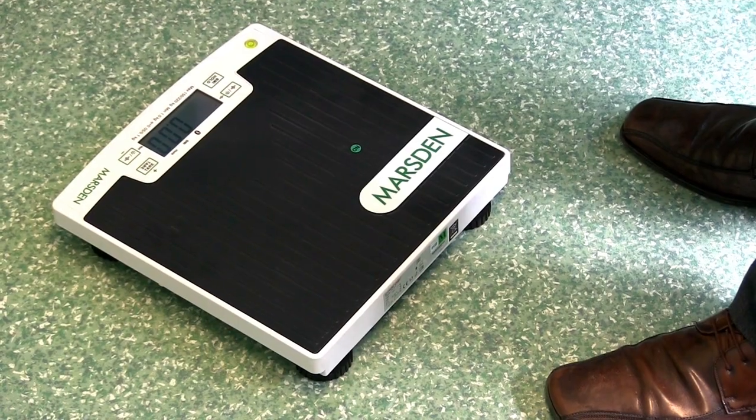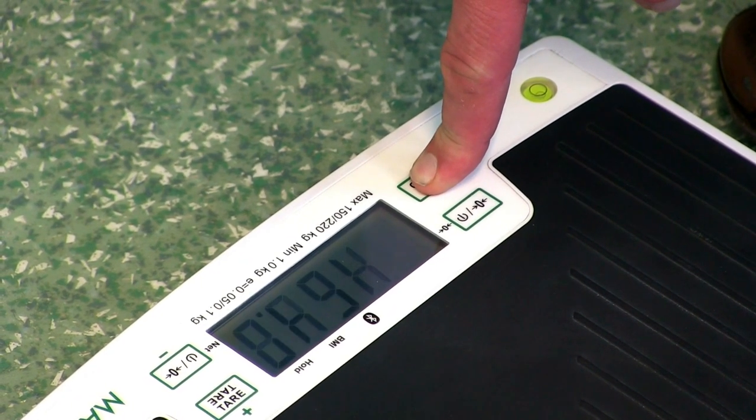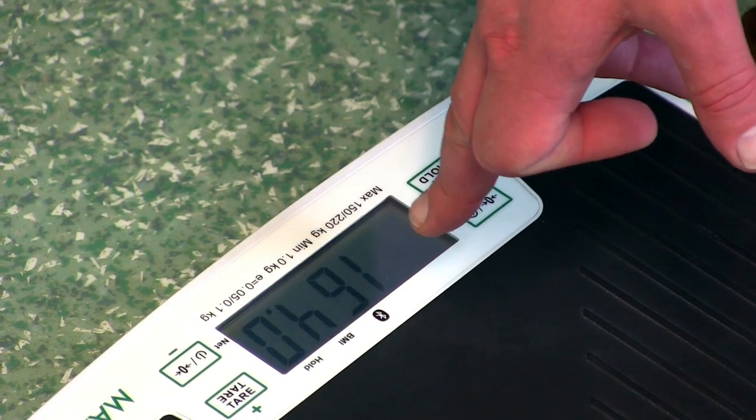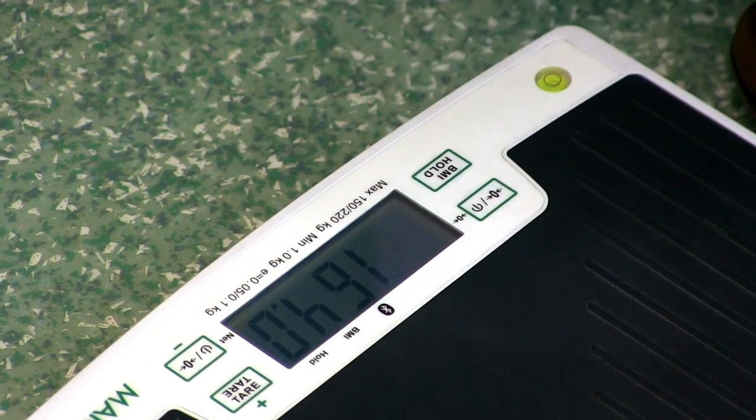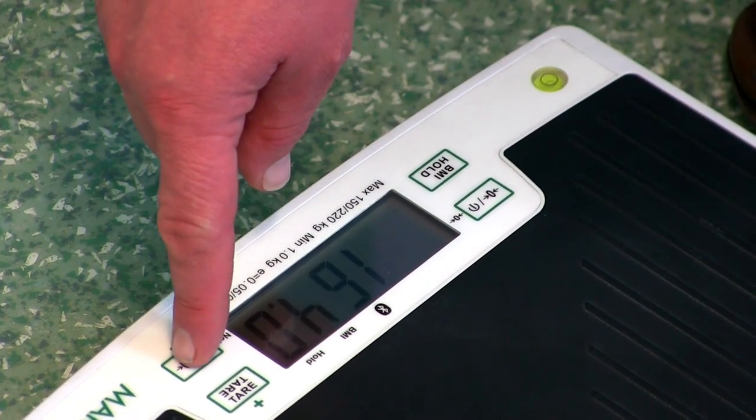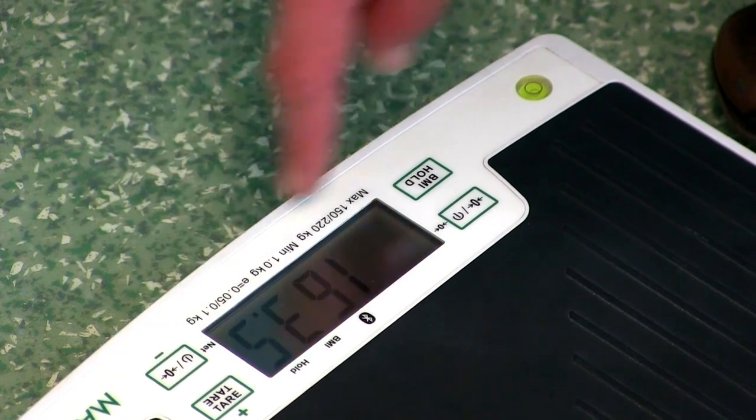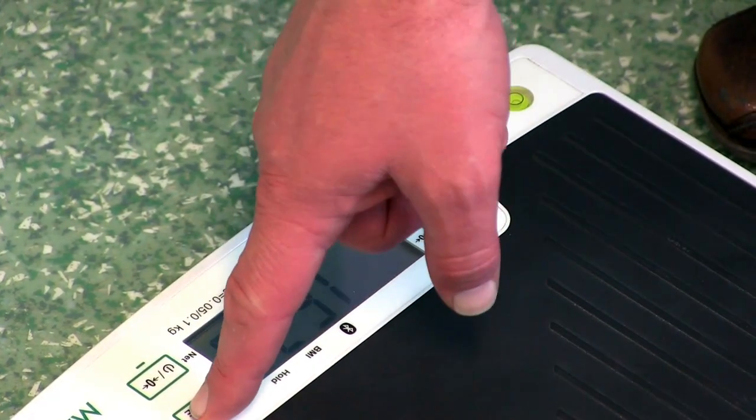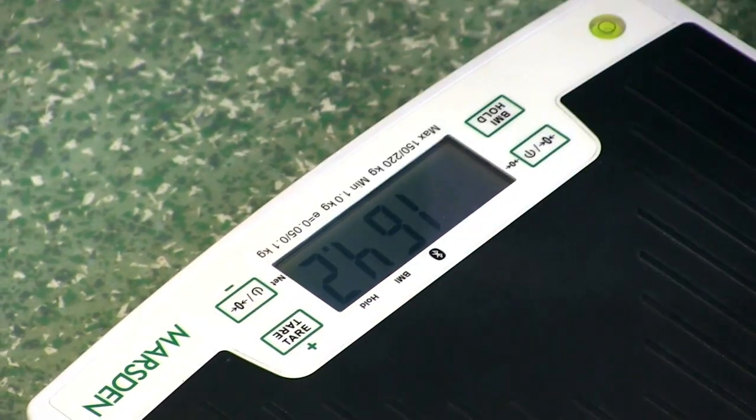The M420 also comes with a BMI function. To enable the function on the M420, press and hold down the BMI/hold button for around three seconds. You'll have flashing numbers on the indicator, and then simply adjust the height using the minus button and plus button until you have the patient's height correctly entered.